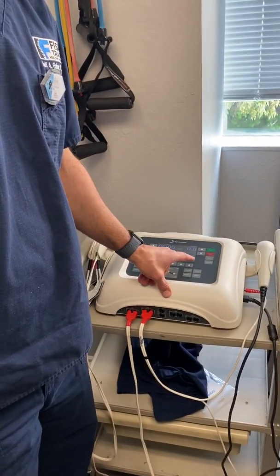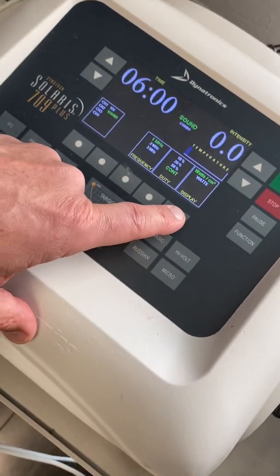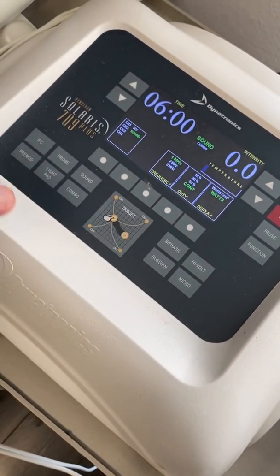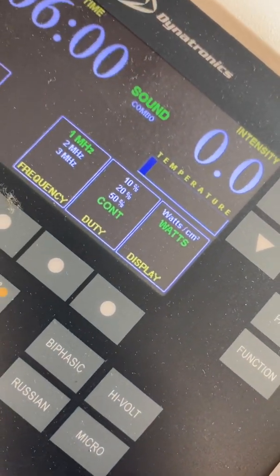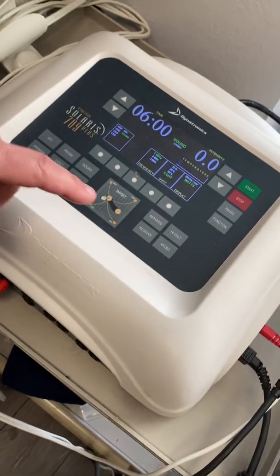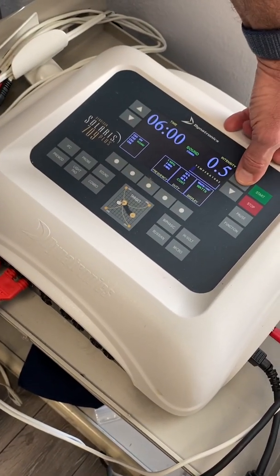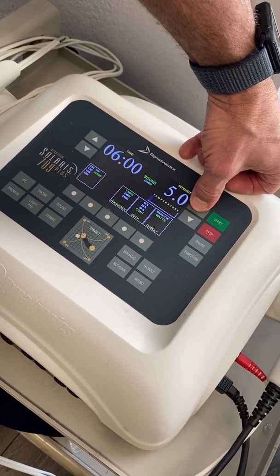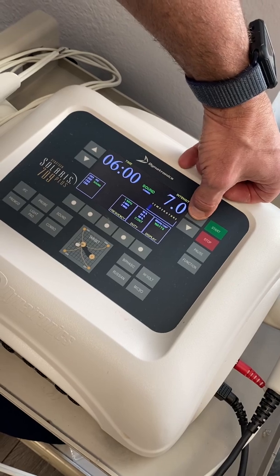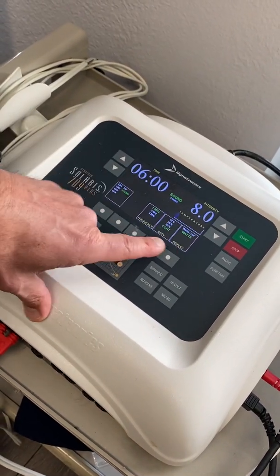watts, okay? And like in school, you might learn watts per centimeter squared. I like to go to watts because it's an easier number for people to remember when I tell them what level they're at, or if I tell staff that, hey, turn this up to 8 watts, okay? Which is, it's a thick area, big muscles, so it can handle more heat, okay? So we have an intensity of 8 watts.